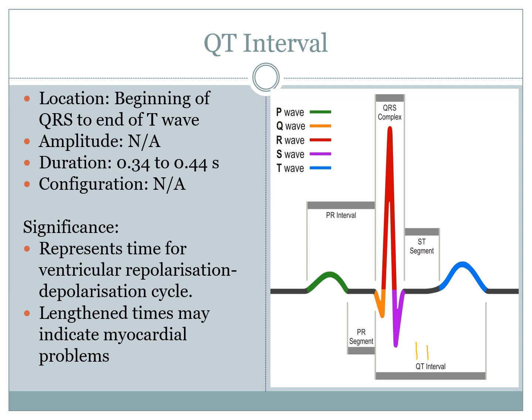Okay, so up to 11 squares. A little bit over, don't get too worried, but if it's excessively short, or more importantly, excessively long, you have to start investigating myocardial problems. We'll talk more about that when we deal with arrhythmias themselves. So that's essentially how the whole PQRST complex works.